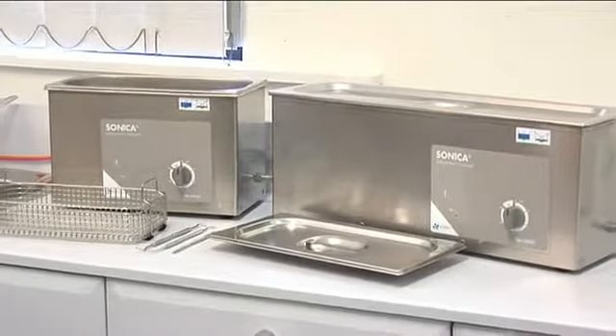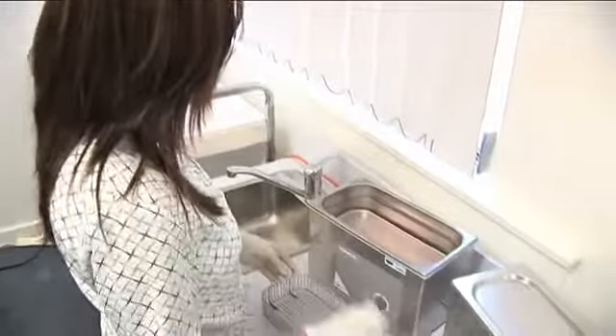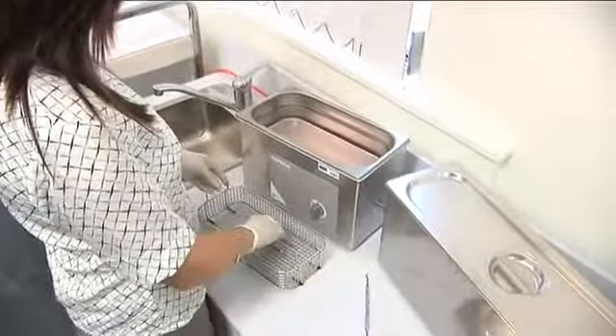The high quality Soltec brand Sonica ultrasonic cleaners are handmade in Italy and offer the best performance to price ratio available.